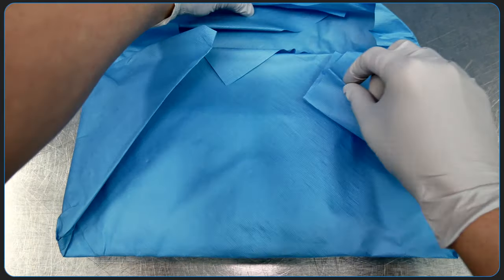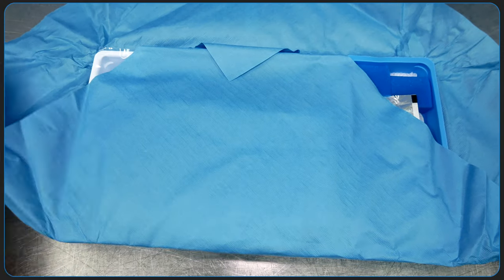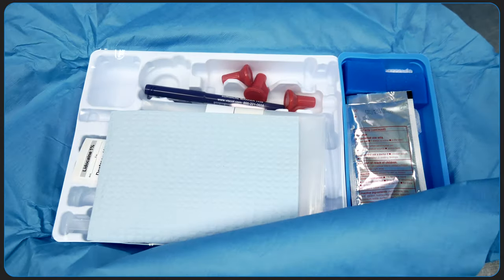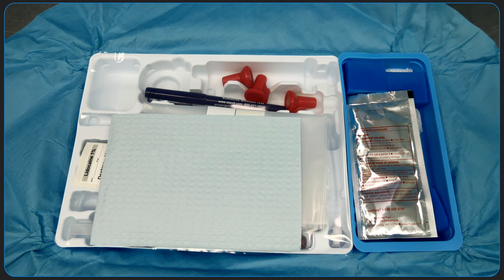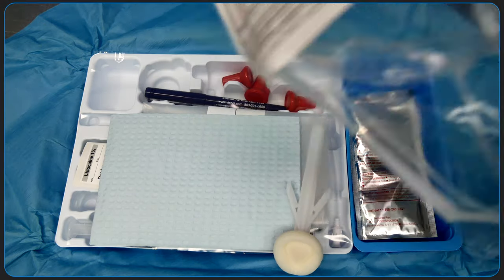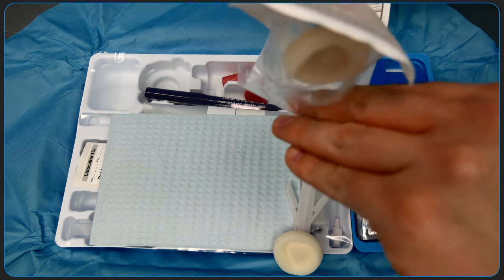To open the kit, grasp the corners of the sterile covering, ensuring that you don't contaminate the kit's contents. Before donning sterile gloves, add two chloroprep sticks to sterilize the patient's back. Everything in the kit is sterile, so prior to handling any of the contents of the kit, we'll have to don sterile gloves.